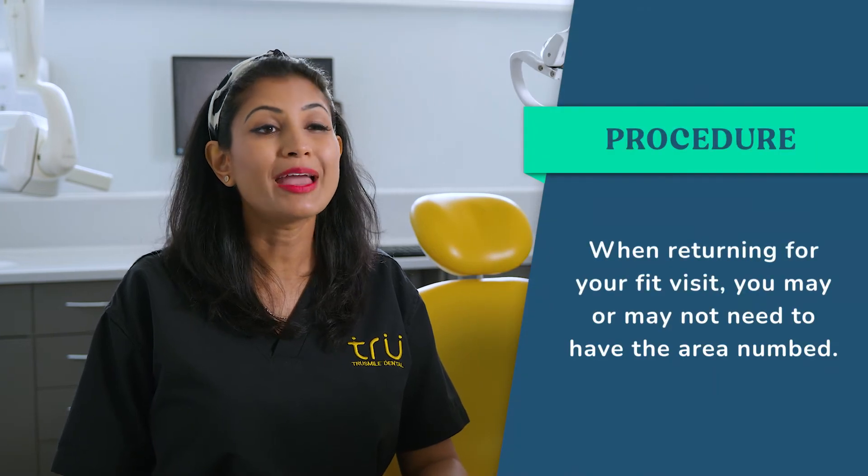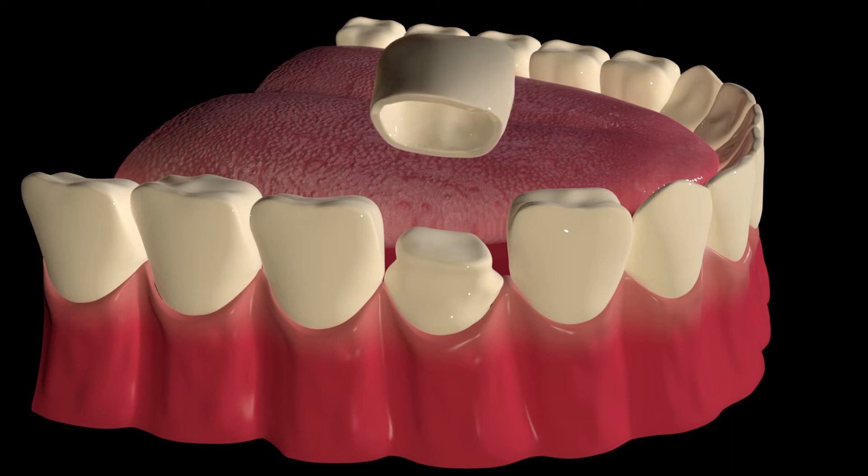When you come back for your fit visit, your dentist will remove the temporary crown. You may or may not need to be numbed with an injection on this visit, depending on which type of crown you're having placed and how sensitive your teeth are. If it's already root canal treated and not sensitive, you likely won't need an injection, but if it is sensitive, your dentist may give you one. Once ready, the temporary will be removed and your permanent crown will be tested and fitted.